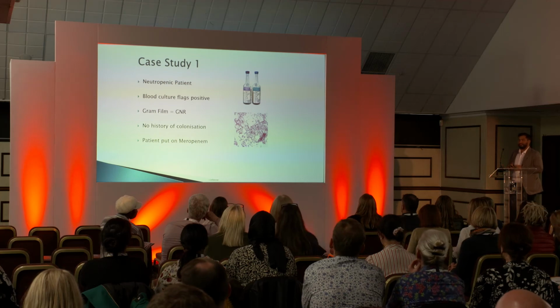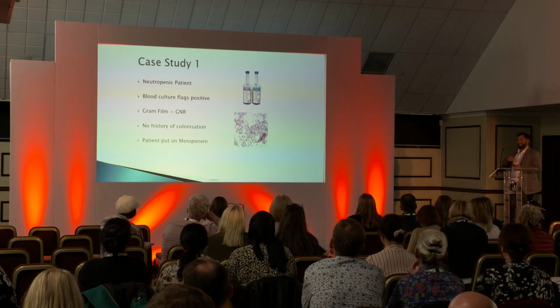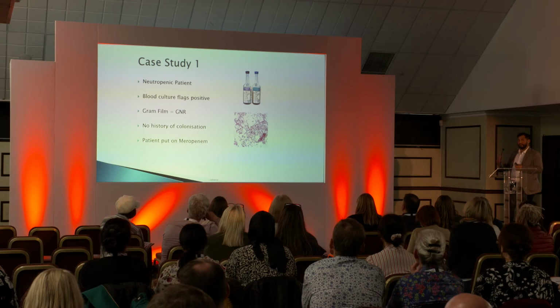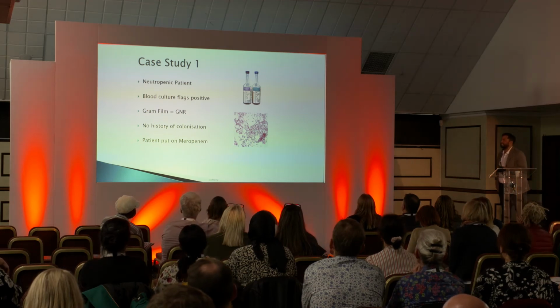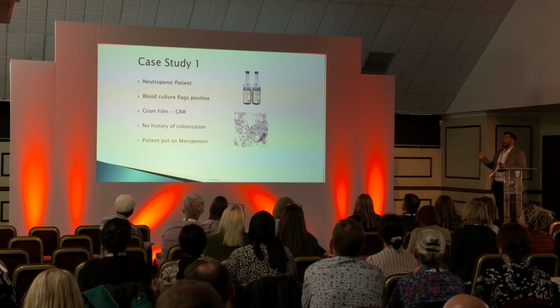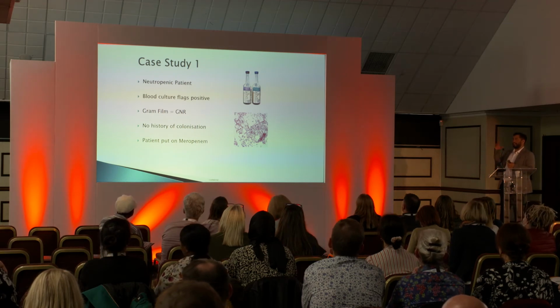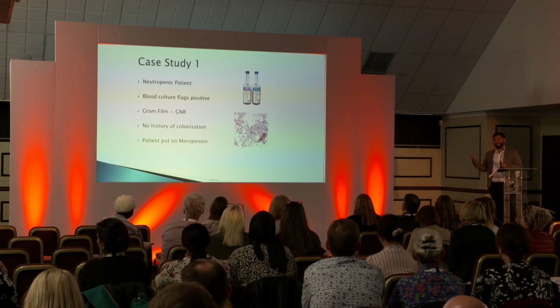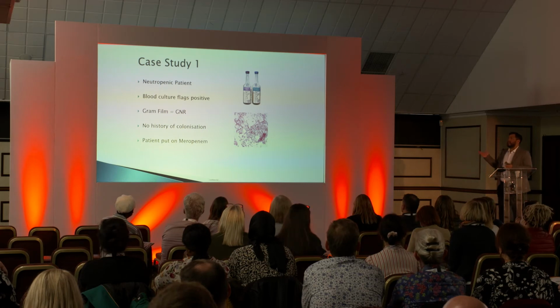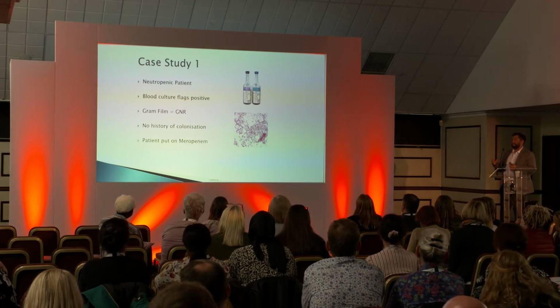Okay, so I'm just going to go through some case studies of patients that have actually benefited from the MALDI-TOF. So firstly, case study 1. This is a neutropenic patient. They had a raised CRP. They suspected there may be sepsis, so they took some blood cultures and brought them to the laboratory as quickly as possible. They were put on the system, and then they flagged up positive.